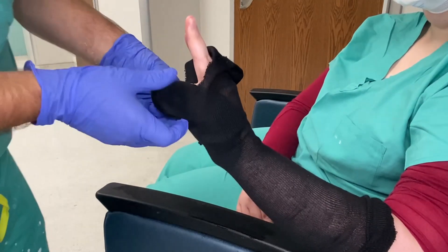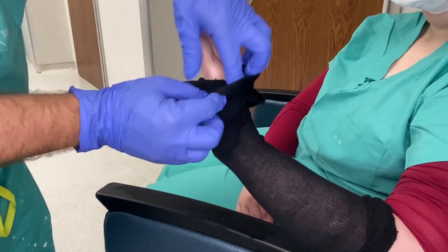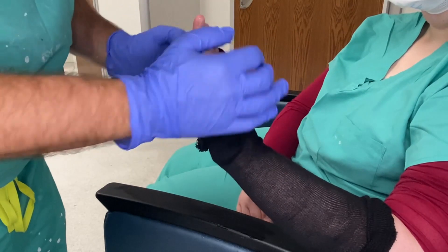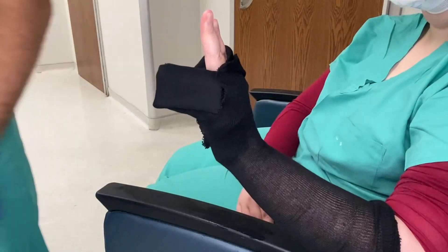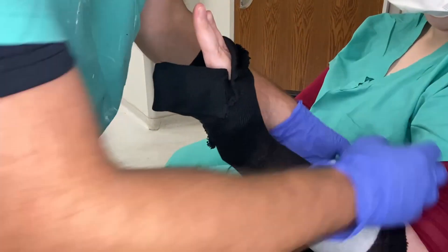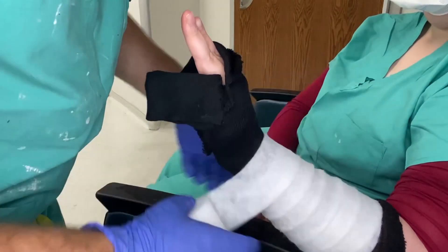The second and third digits are nice and free, and the fourth and fifth digit is tucked in and ready to be casted. Take the two-inch cotton roll and start rolling proximal to distal with a nice 50-50 overlay. Keep it nice and even for a good, even cast.